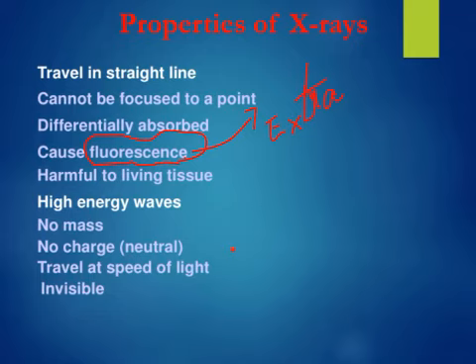High energy waves, it is good because we can take the diagnostic X-rays that we want and we can see what is the problem inside that area of the body. Then high energy waves, no mass, no charge, travel at the speed of light but invisible.